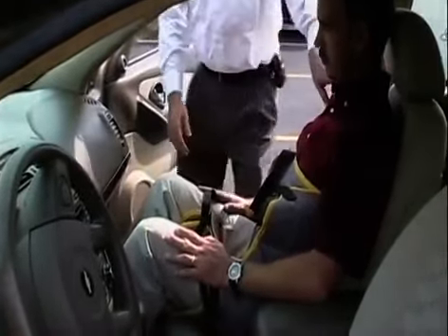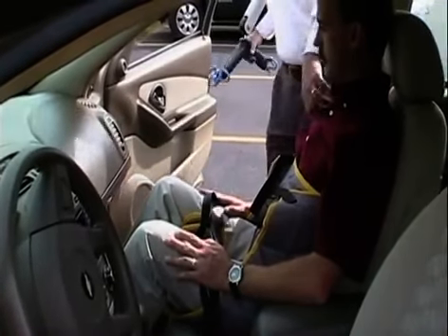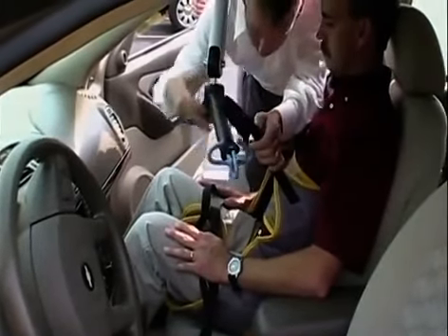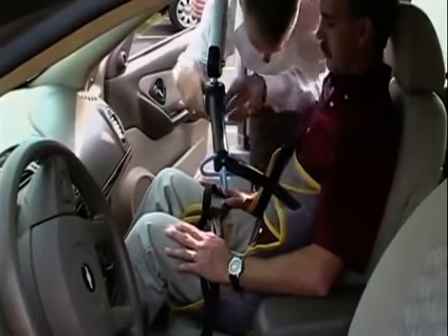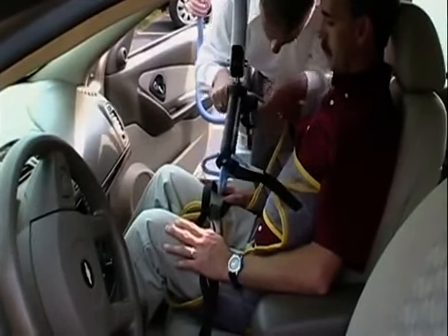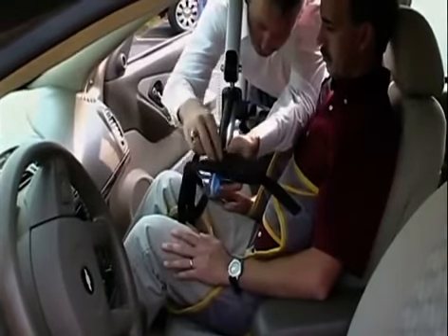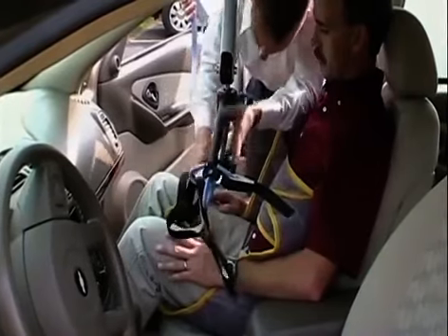Now, I'm going to bring the equipment up. We're going to make connections with those sling straps for you. I'm going to use the two that are connected to your shoulder section and place them on the hooks closest to you, and then I'm going to use the two that are on your leg section and put them on the hooks that are furthest away from you. There are two extra hooks, but we're not going to use those.